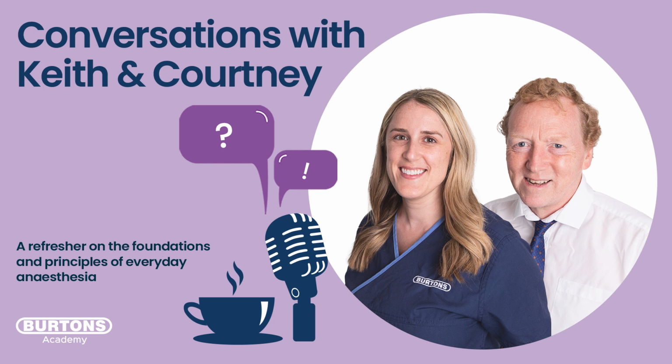So we're a long way to setting up our machine now. We know our volume. We know our inspiratory time. We've got to think about more or less 2 other things now. One of them is the expiratory time or the respiratory rate, whichever way you want to think about it. And this may be dictated by the machine. The machine might give you the option to set the expiratory time, in which case you've got to do a little bit of maths, haven't you, and work out what the expiratory time should be.